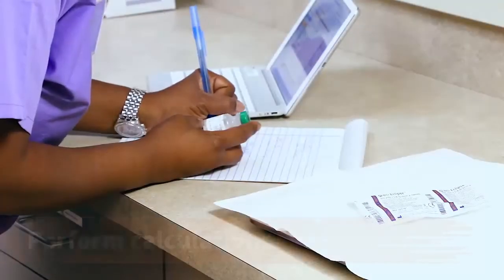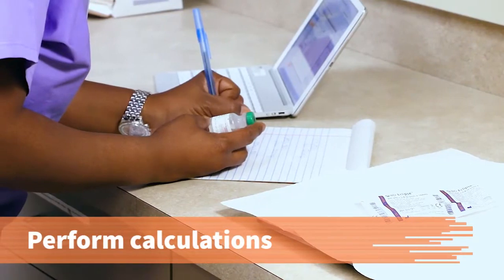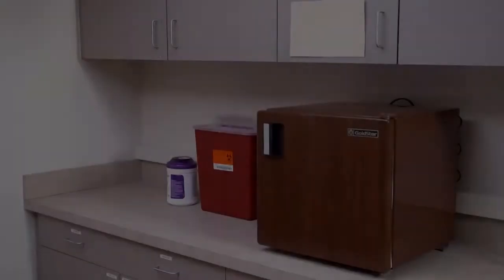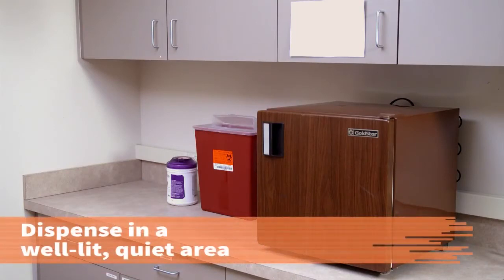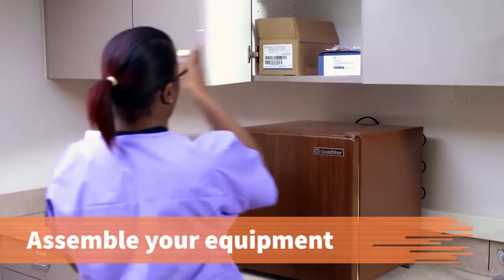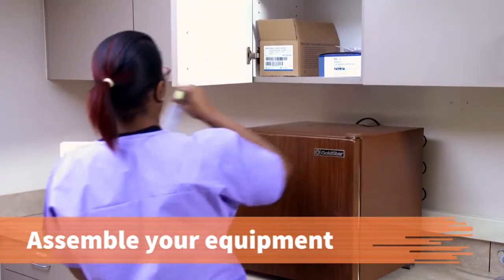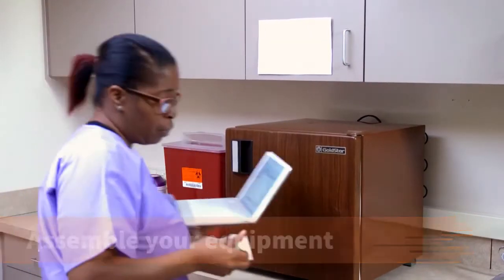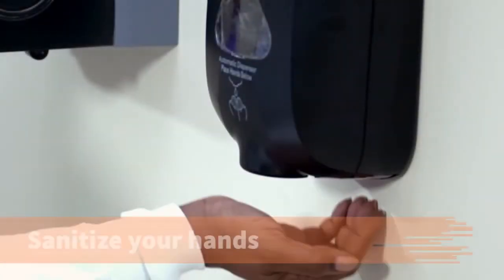Perform calculations needed to match the provider's order. Confirm the answer with the provider if you have any questions. Dispense the medication in a well-lit, quiet area. Assemble the required equipment. Choose the correct syringe and needle unit, depending on the site of administration, patient characteristics, and the amount of medication to be injected. Before you dispense the medication, sanitize your hands.